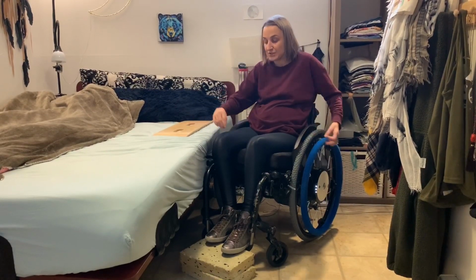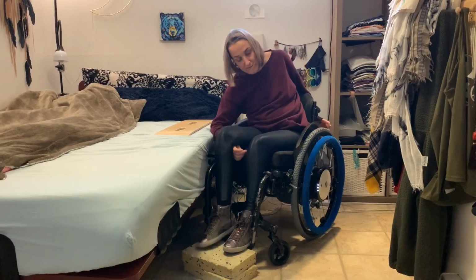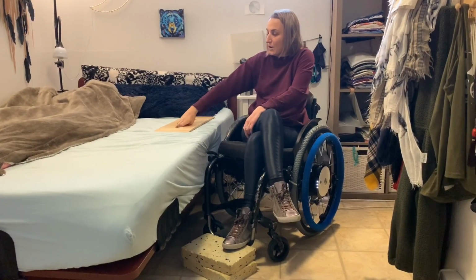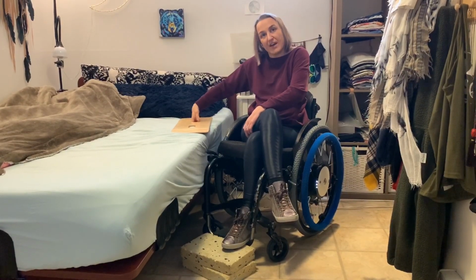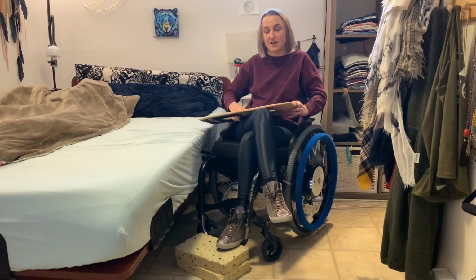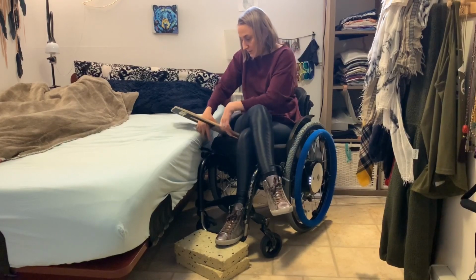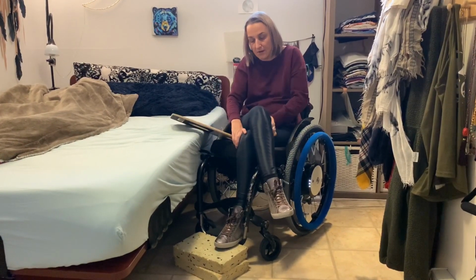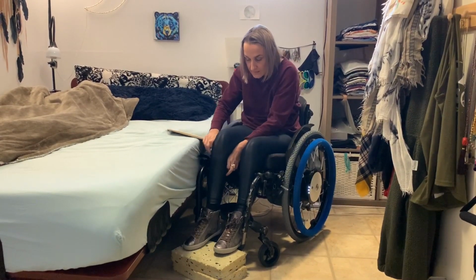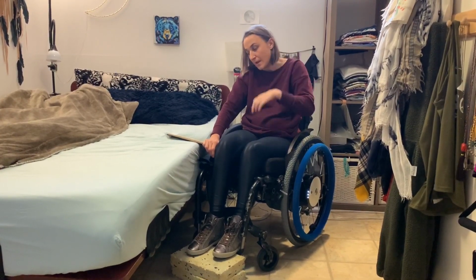Okay, so the first thing that I do is normally cross my legs to get the board underneath me, and that helps to wedge the board a little bit better, I find, rather than trying to move it around, especially without my hand control. Once the board's there, I can uncross, and the block at the bottom prevents my legs from dropping to the floor.